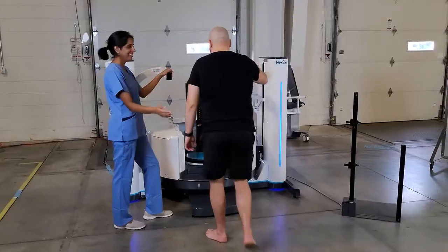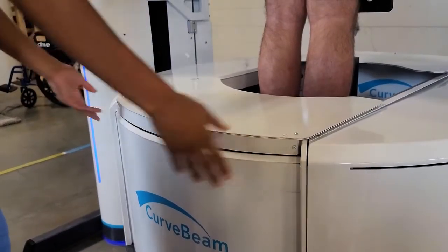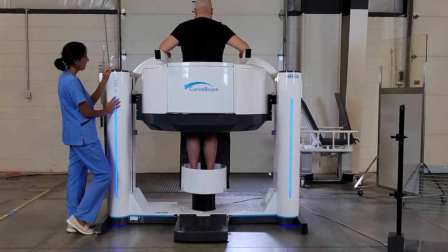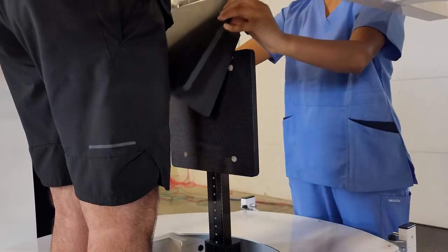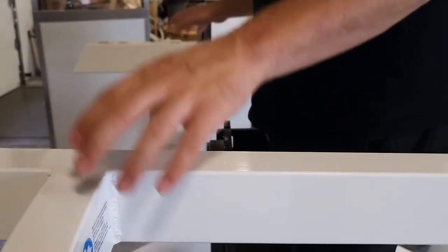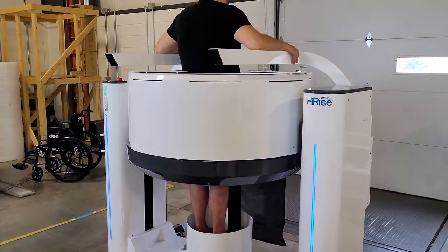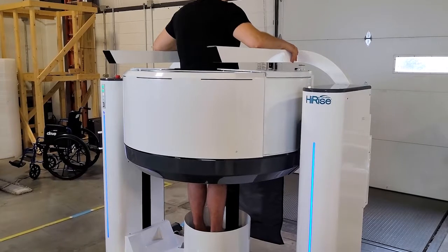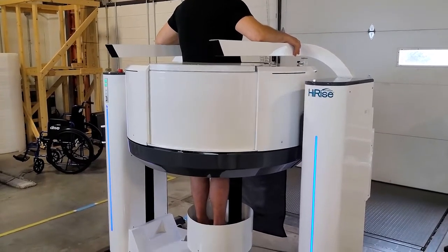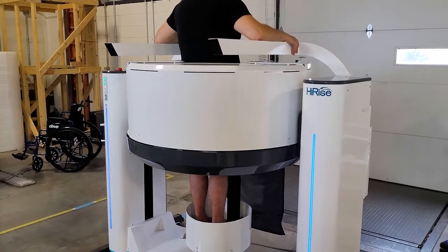The patient steps into the system and places both feet on the platform. The gantry raises to the height set by the external markers. A knee stabilizer and two handlebars help the patient stay still during the scan. The entire hip volume is captured in one 360-degree gantry rotation. The total scan time is about 30 seconds, with X-ray firing for about 13 seconds during a hip scan.